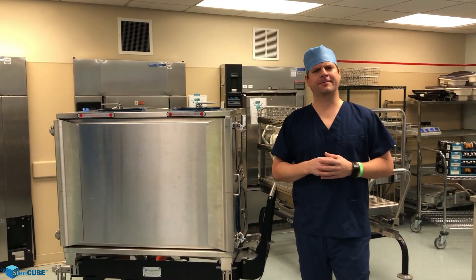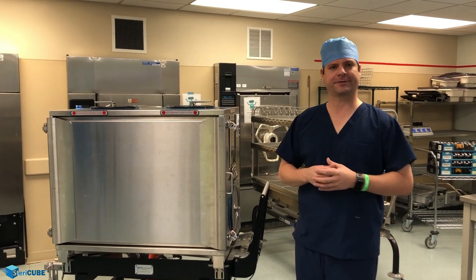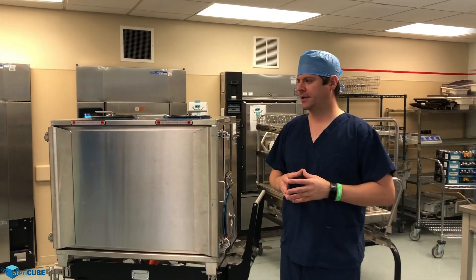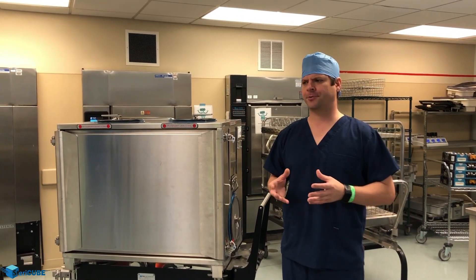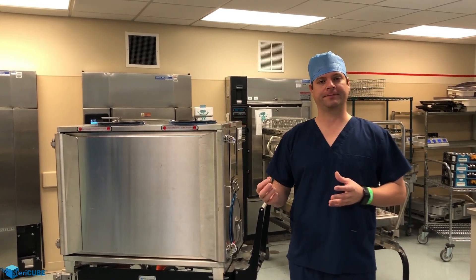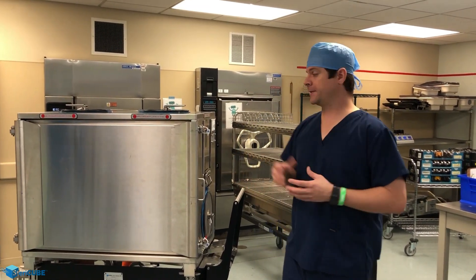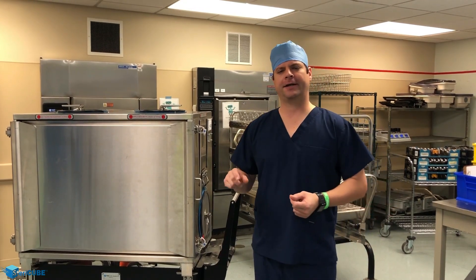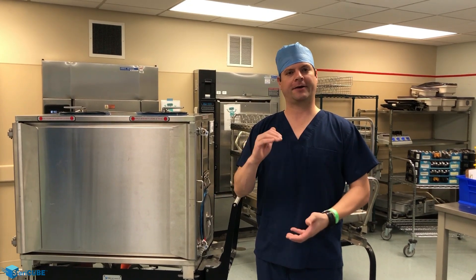I'm Jeff Berger. You might ask, why is a mechanical engineer with an MBA and process design background talking about a sterilization system? I've worked with SPDs before in achieving ISO certification and raising quality. One of the most important things to do is look at the different factors that go into great quality delivery — looking at them and being able to control them in a reliable, repeatable way. What really attracted me to the Stericube was that it retrieves a bunch of those factors throughout SPD, consolidates them, and allows the system to be designed for great quality delivery.